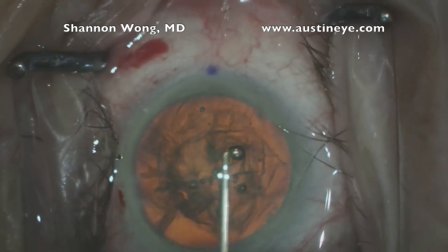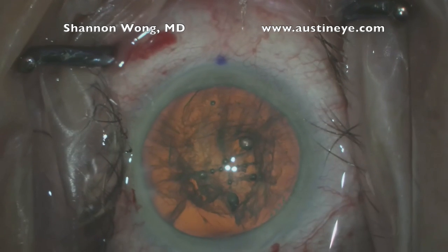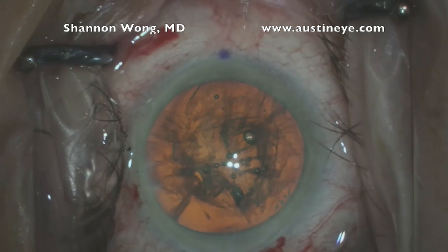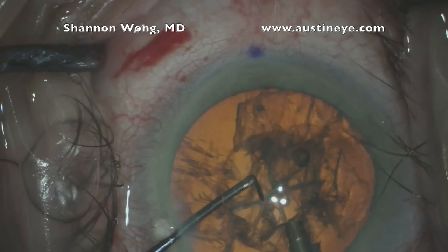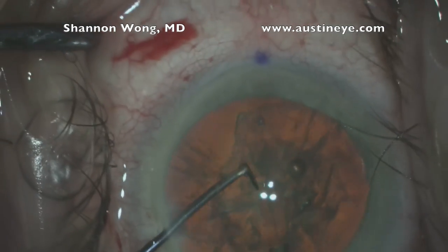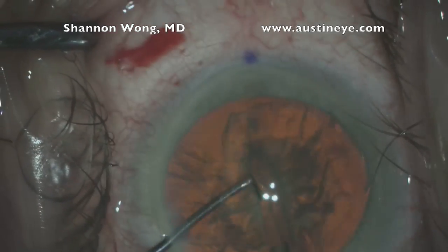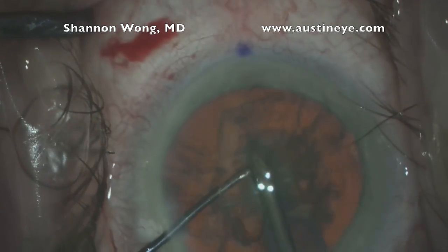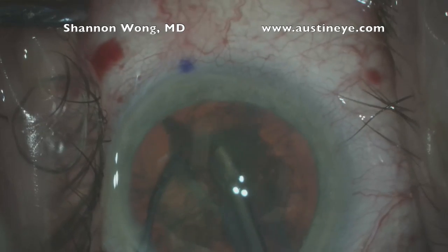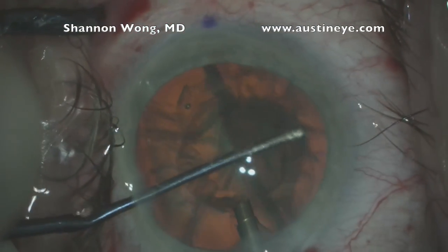In this patient we've created a 4.5 millimeter capsulotomy. We do our usual hydrodissection and begin routine phacoemulsification of the cataract. We have employed a divide and conquer technique and we use an Olsen chopper made by Epsilon Instruments.